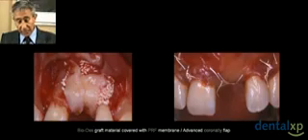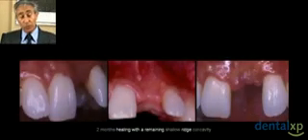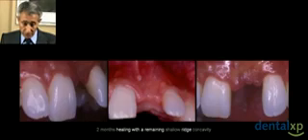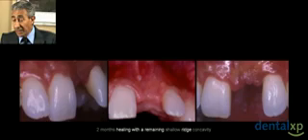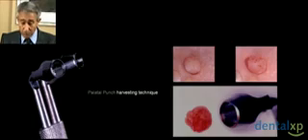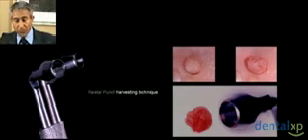And then on top of that, instead of using a membrane, we are going to put 2 membranes of these PRF growth factors. Then we make a coronally advanced flap to cover nicely all the things we have put in, the implant, the bone graft, the PRF membrane, etc. We let it heal for 2-3 months, and we find that yes, we have achieved an improvement of the situation, but still we need something more.